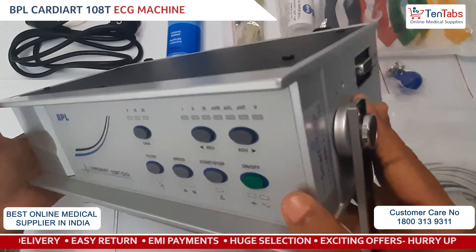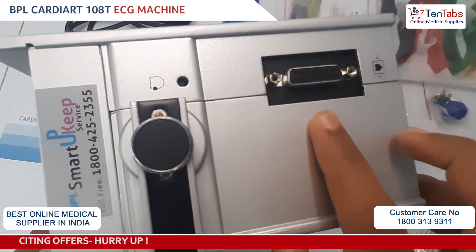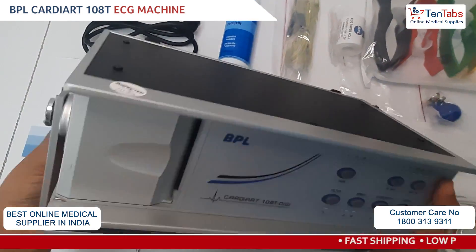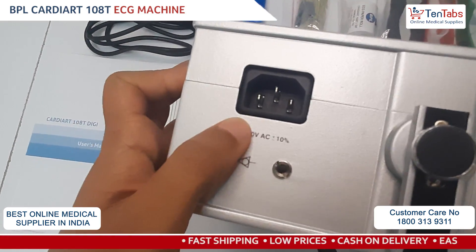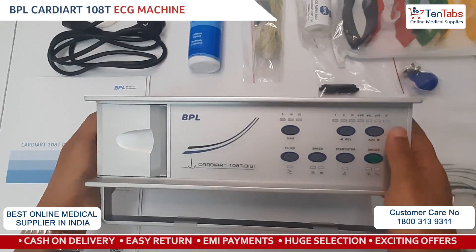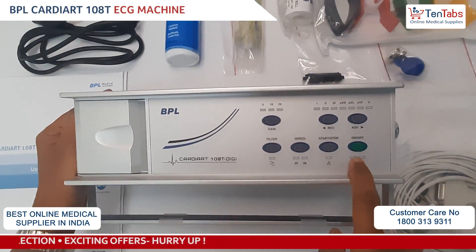Towards the right you can see the connection for the patient cable — the ECG patient cable — and towards the left where you can connect the power cord.